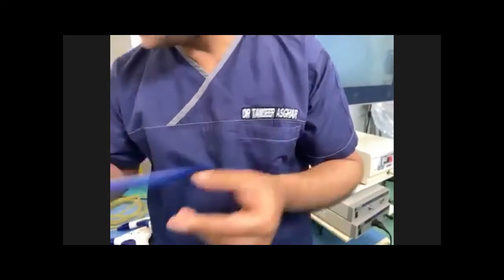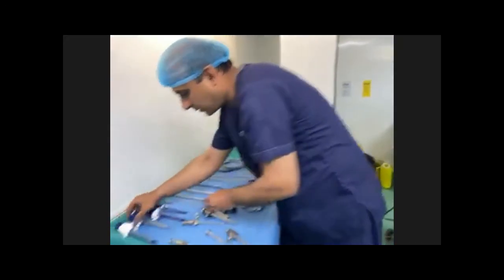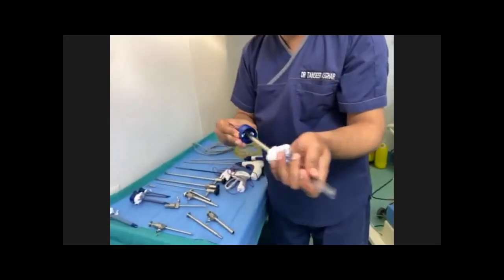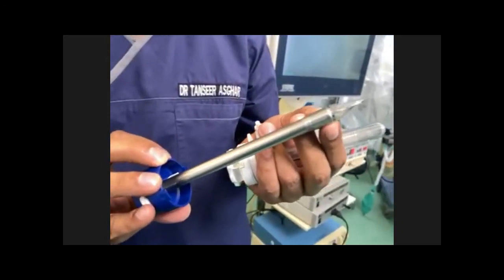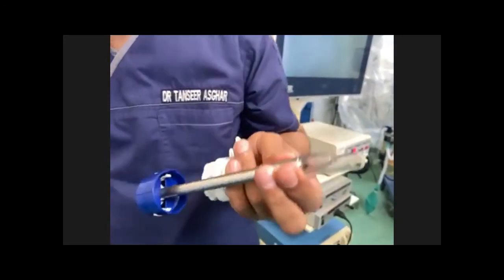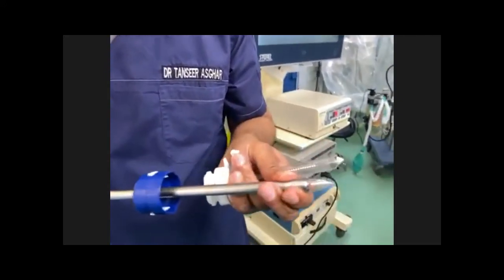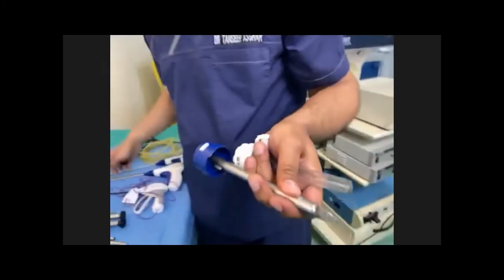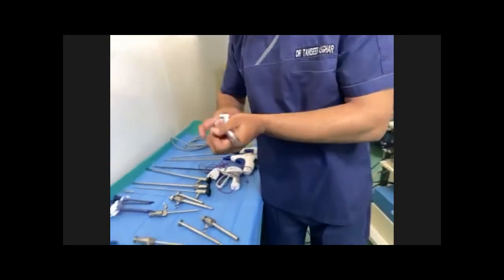Then there is another type of trocar which usually is available in the disposable ports. It is called an optiport or optical port. Because when you put the camera telescope inside it, you can visualize everything on the screen, every layer you can visualize. So this is all about trocars.